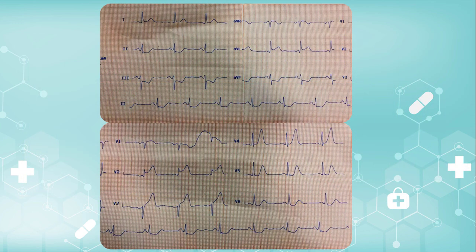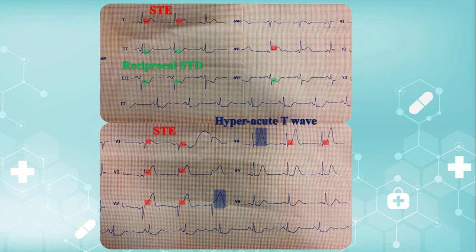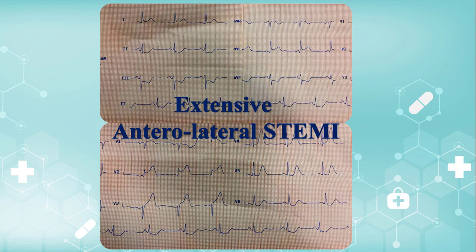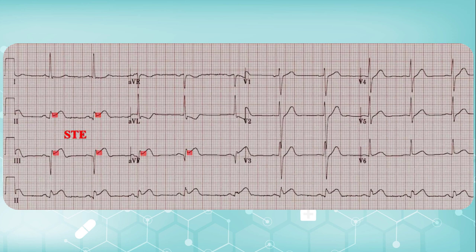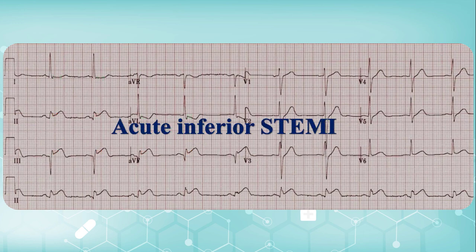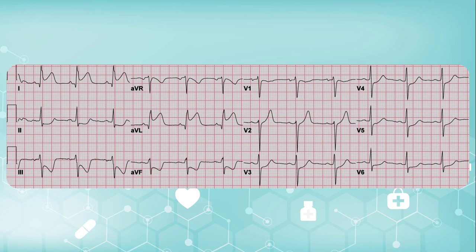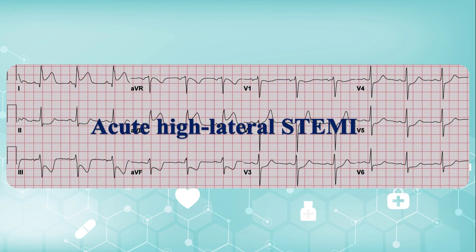Let's go through several examples. The present EKG demonstrates ST elevations in V1 to V4, D1, and AVL with reciprocal ST depressions in inferior leads. Tall T waves in V3 and V4 are present as well — so this is extensive anterolateral ST elevation MI. The next EKG demonstrates ST elevations in inferior leads with concomitant reciprocal ST depressions in D1 and AVL, establishing acute inferior ST elevation MI. The last example illustrates prominent ST elevations in D1 and AVL with reciprocal changes in inferior leads, so high lateral ST elevation MI is present.